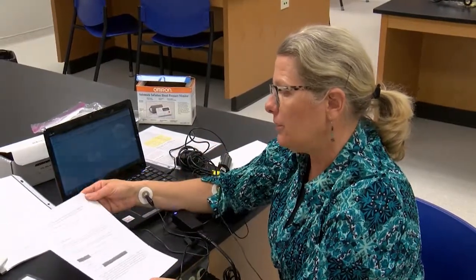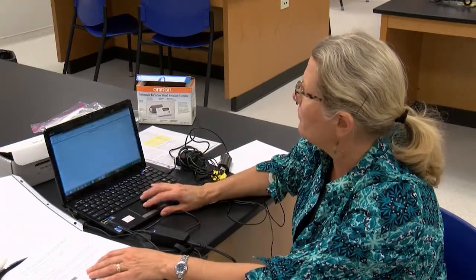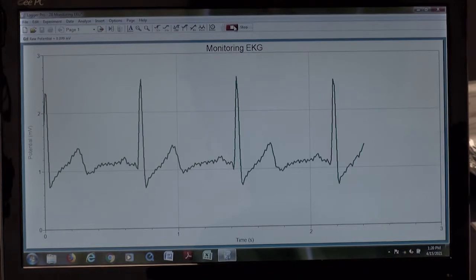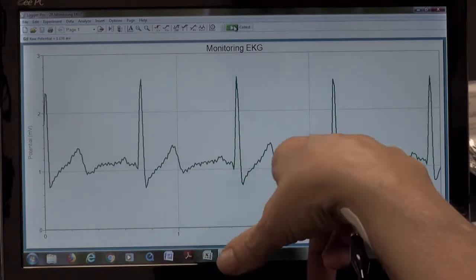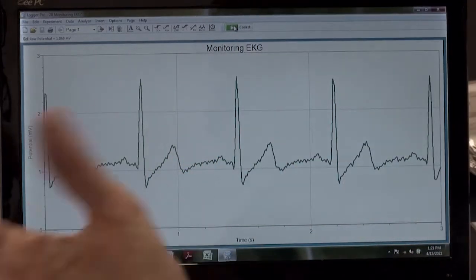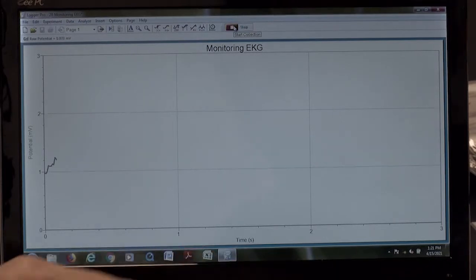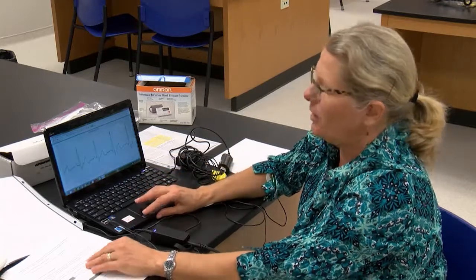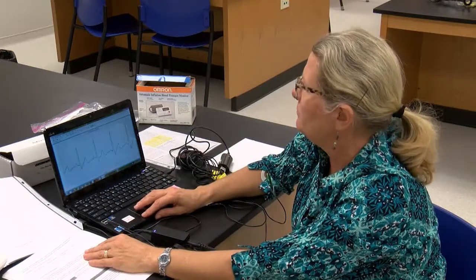So what I'm going to do is sit relaxed and collect data on the monitor here. Now, notice all this chatter, all this disturbance. That could be because I was just talking. In fact, let's have some fun, and I'll press collect and I'll be talking. So this is when I'm talking, so you can see there's a little disturbance. Now I'm going to try to remain very, very calm. But I did drink a lot of caffeine this morning, and so this may all be due to the caffeine. Okay, let's see.